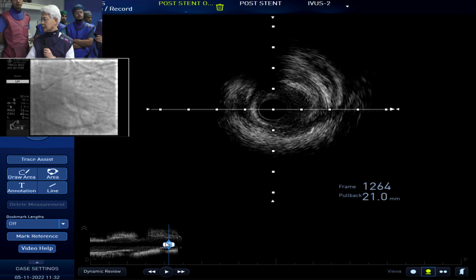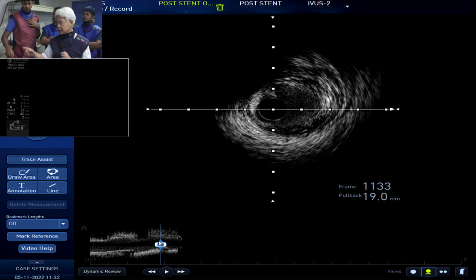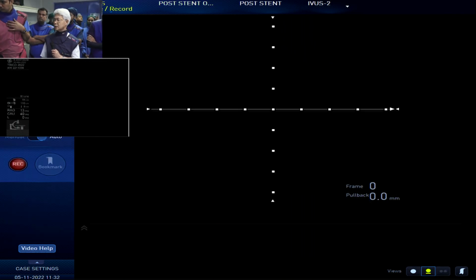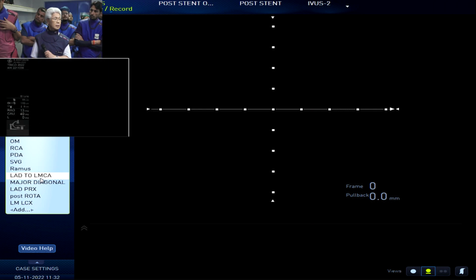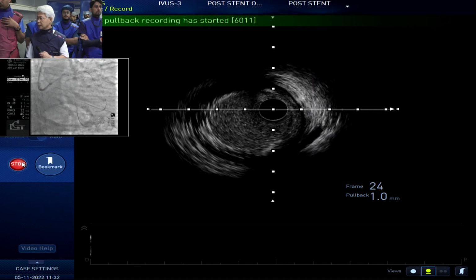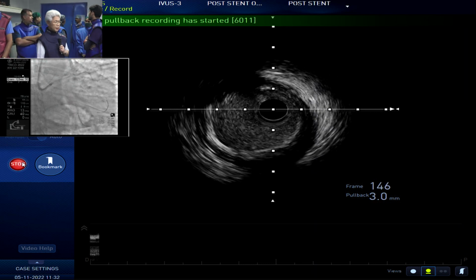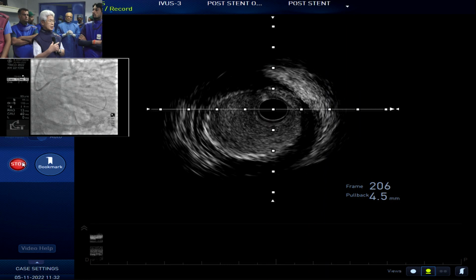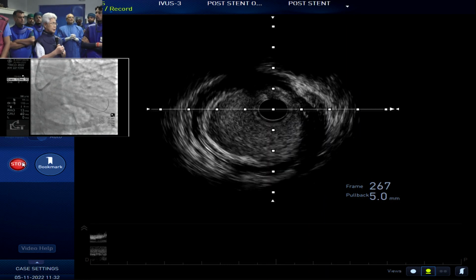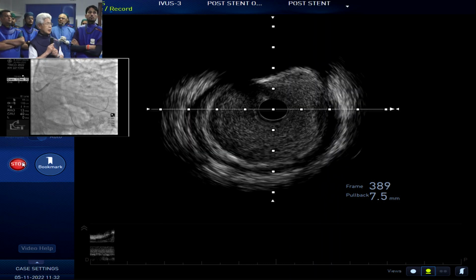Okay. So what will be the statement? Okay. Can I do IVUS? IVUS, left main, okay. We already measured. Okay. Left main. Dr. Akasaka, which hematoma would you intervene on? Yeah, in the distal, if you have the distal edge hematoma, it sometimes expands, and you may have stenosis, right?